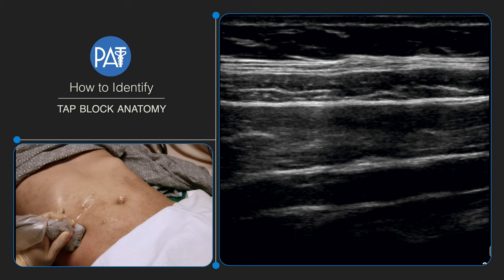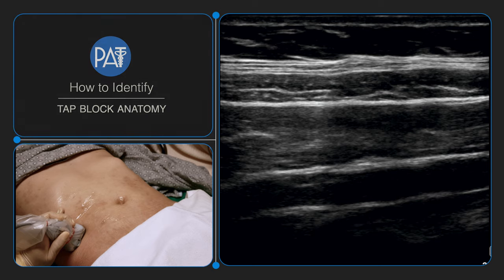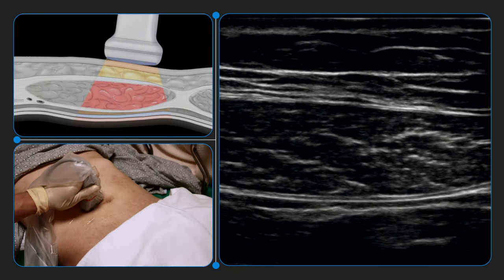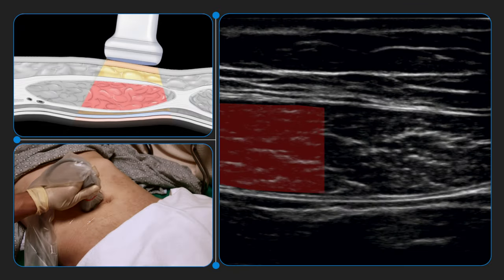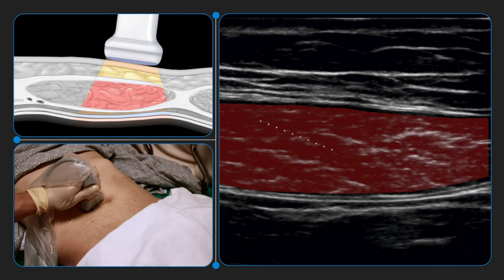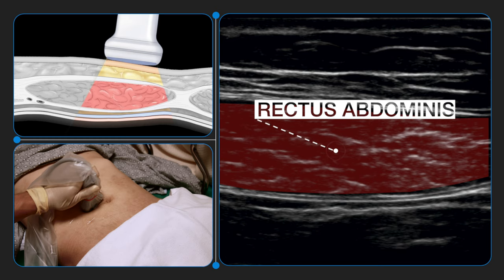One of the challenges with TAP blocks is correctly identifying the layers, and this is even more challenging with static ultrasound images of the target anatomy. Instead, consider starting midline to identify the oval-shaped rectus abdominis muscle, which is positioned under the superficial fascia of the abdomen.